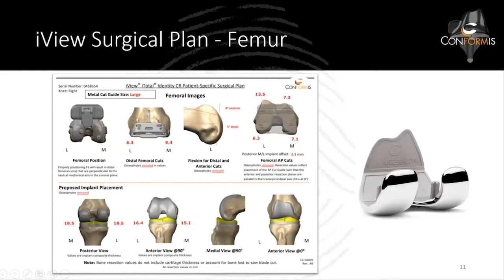These are the accentuated portions of the femoral side. We're using a large cutting guide, and we'll cut 6.3 lateral and 9.4 medial. You can see the offset that is dialed in on both the J curves of the femur and the position and localization of the implant. This is representative with the osteophytes removed, so you can get a bird's eye view of the main key portions that you're cutting.